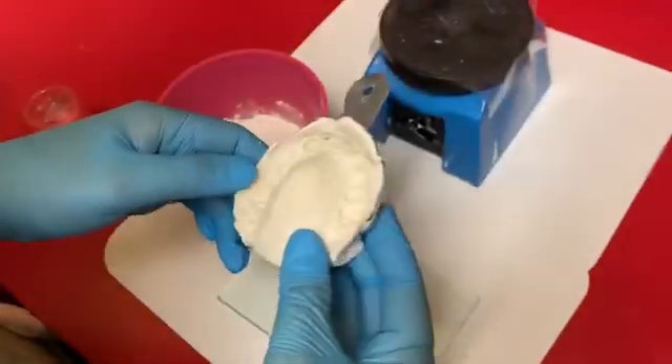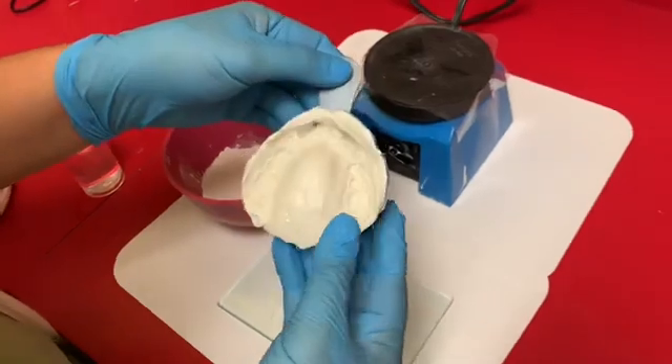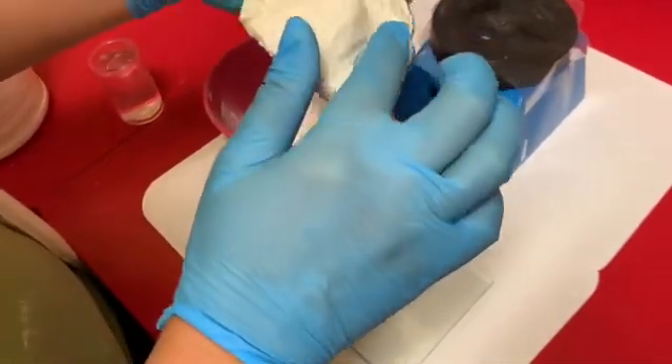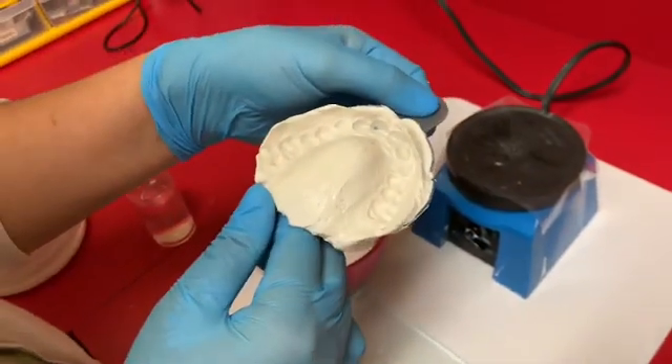We're going to pour it up and get it ready for the lab. Here is Nicholas's alginate impression — I like this one because it got all the way up in the fold of his lip so we can get a nice custom fit when the lab gets it and forms his mouth guard.